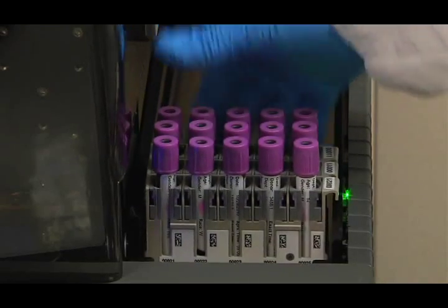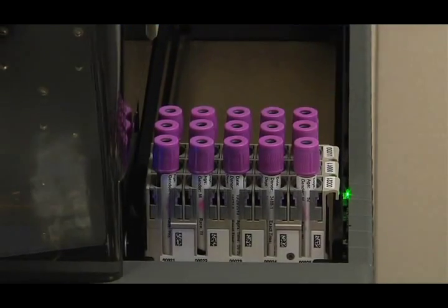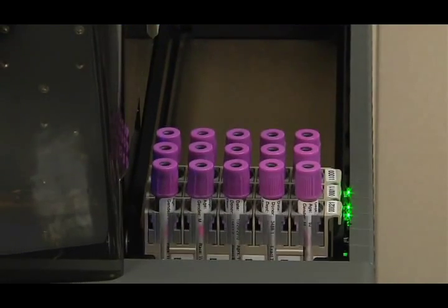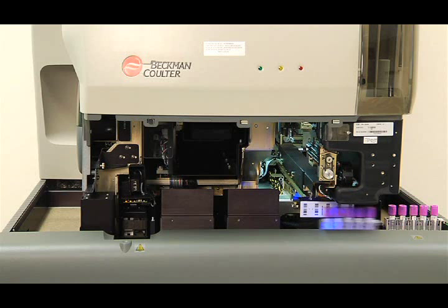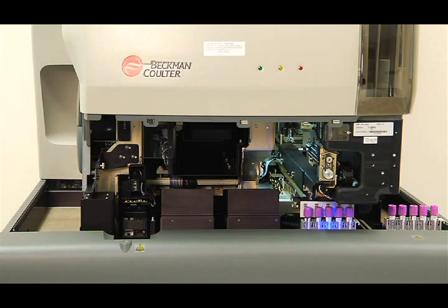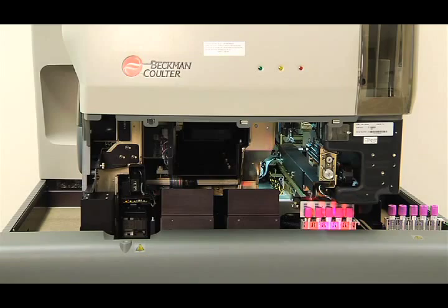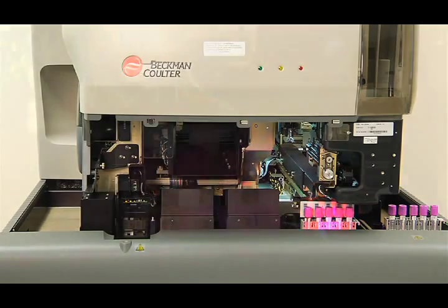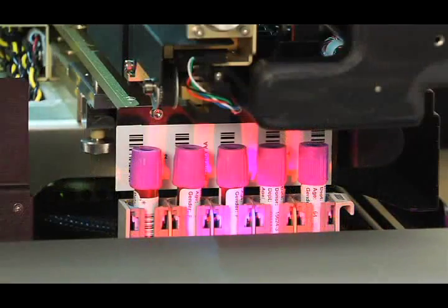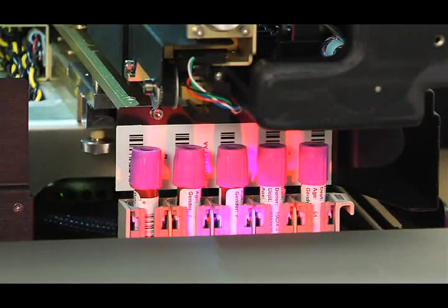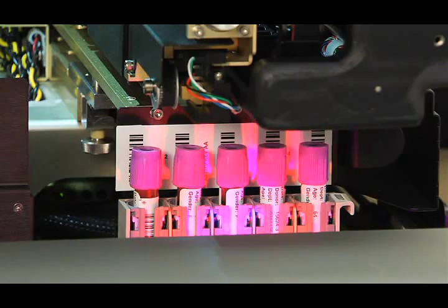The magnetic force advances the samples to the barcode reading station. This is the location where the SlideMaker Stainer module collects sample demographics. The barcode reader uses state-of-the-art digital technology.